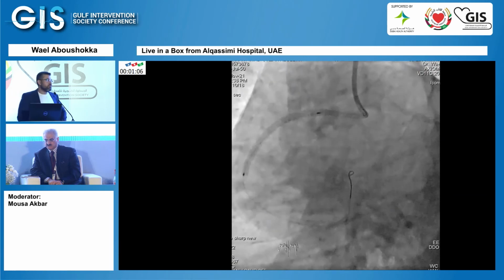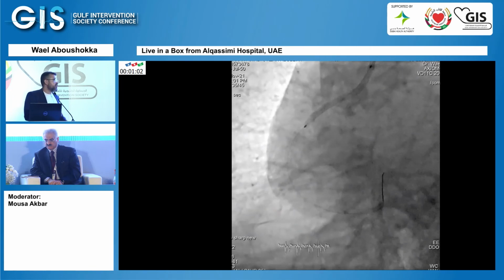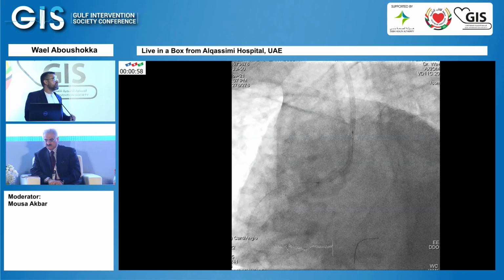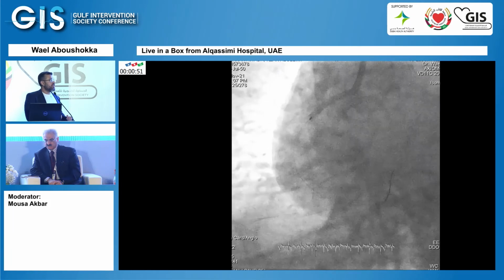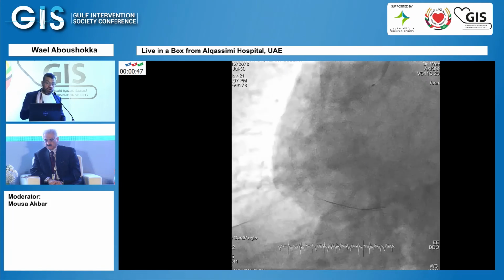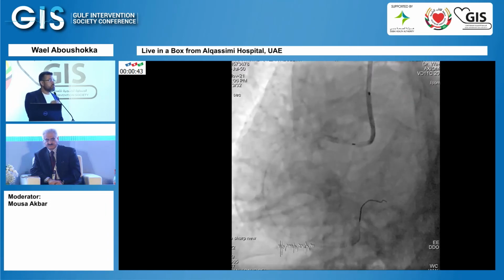I know most of the floor and my colleagues are very talented, but what I really know is that we cannot control as humans this 1 millimeter by 1 millimeter fashion. You can pull it will be 2 millimeters, but here you are sure that you want to pull 1 millimeter or advance 1 millimeter.